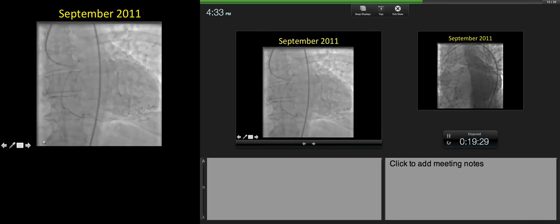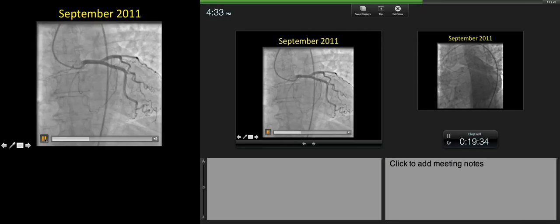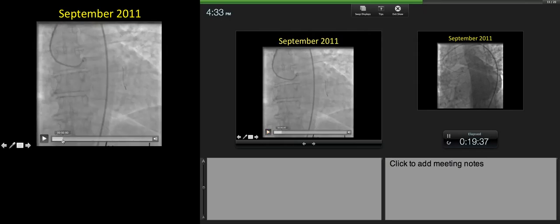In order to be able to move the guiding catheter exactly where you want it, you see the shadow of the stent that they are beginning. But then we couldn't visualize very well, and we had the impression that it was because of the guiding catheter position. We put the guide wire to stabilize the system and allow us to go back and forth with the guiding catheter.